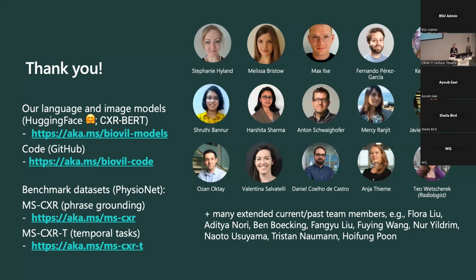In principle, what we do find is that because we're trying to match with the impression section, our model ends up being pretty good at extracting the features that are pertinent to that. So the key findings, but it doesn't necessarily pick up on the more nuanced aspects of the image. So the data quality is really quite an issue in all of this. I'm trying to make sure that you're not feeding it noise. There's also, these models pick up a lot on association. For example, part of the team has been looking at the association with pneumothorax classification in tubes, because the model can see a tube. It might not be able to see a real pneumothorax, but maybe there's a pneumothorax. So some of these challenges in the data set are quite bad. But that tube could be for fluid as well, so.